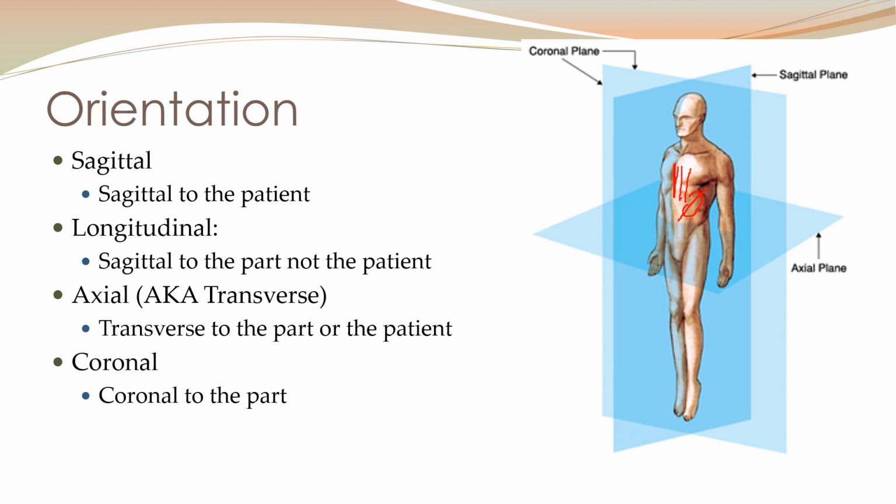Now this will be important when you're doing a lot of your central line placements or looking for vascular access, things like that. The arteries and veins are not necessarily going to lie in the sagittal plane. So most of the time you're really just scanning in long.